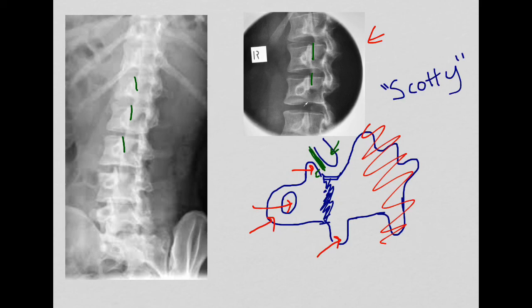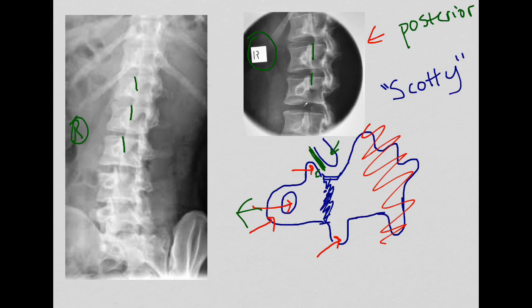Scotty gives you all sorts of good information. Scotty's nose is pointing towards the side that we're looking at. Remember that we are doing posterior obliques, which means we're looking at the same side. Because this is marked with the right, Scotty is facing towards the right — so we know we're looking at right-sided pars interarticularis and right-sided structures. Look for Scotty's nose and look at what side he's pointing to. If this was an L, we would be looking at left-sided structures.